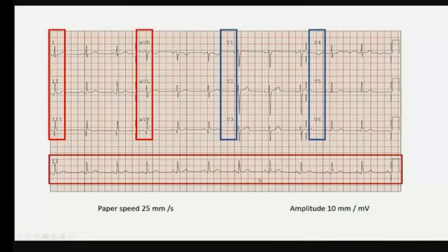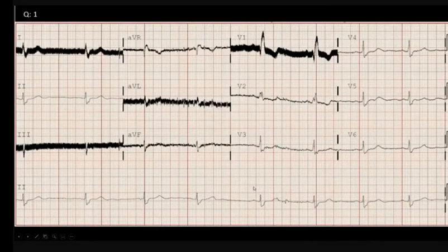So let's go to question number one, if you can put that up, please. This is a 77-year-old man with a history of hypertension and Parkinson's disease, and he presents with high fever, intermittent dizziness, and falls. The ECG shows: extrinsic electrical artifact, tremor artifact, loose limb placement in electrodes 1, 3, AVL, AVR, and V1, or rigors due to skeletal muscle artifacts. The patient has high fever. Now you can go and choose your answers, A, B, C, D, and then we'll have 1 minute.